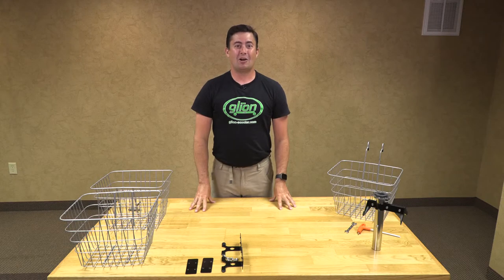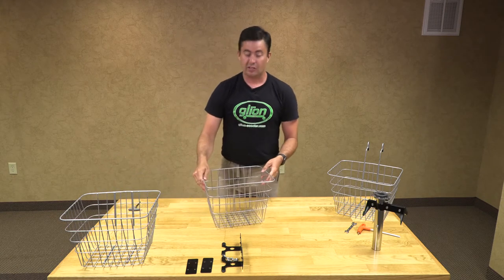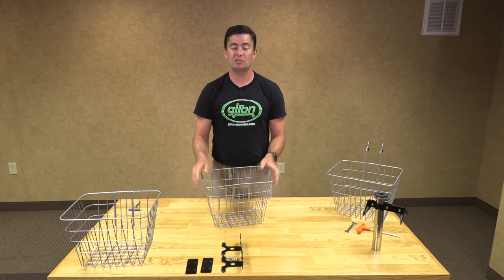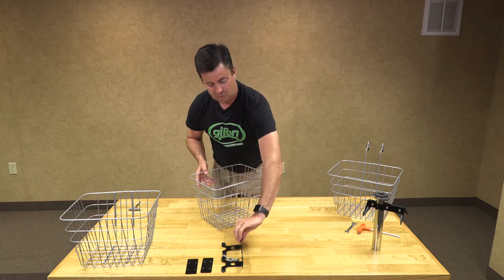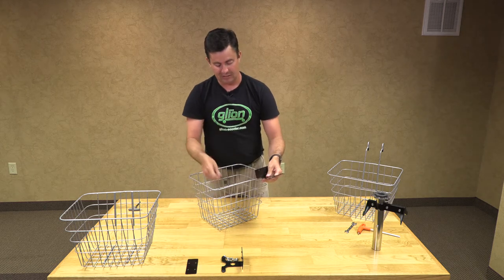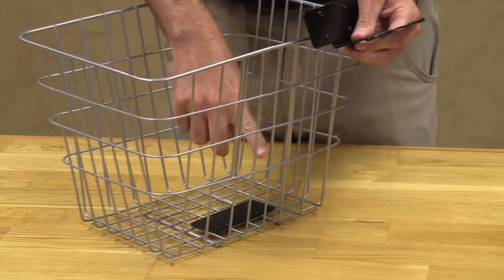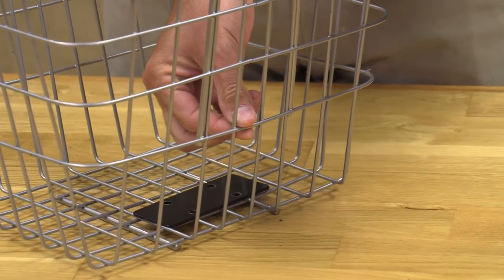Now we are going to add our brackets to the side baskets. You will notice on your baskets that on one side there are two added supports — these are going to be the sides that go to the inside of your scooter. First we will take one of our brackets and one of our backing plates. The backing plate goes on the inside.